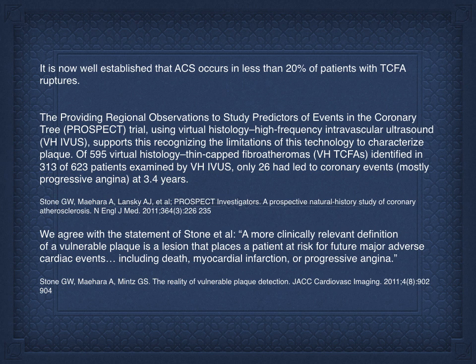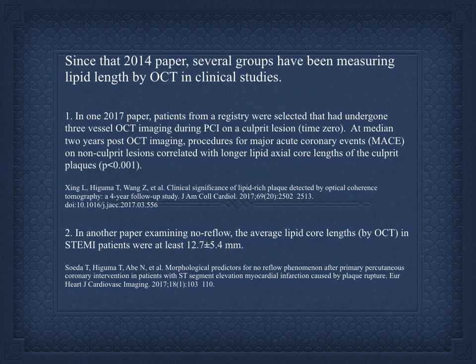distribution. So we've known prior to the PROSPECT study that less than 20% of TCFAs lead to acute coronary syndromes, but the PROSPECT study obviously was very important in confirming this, and I repeated that quote from the Stone group below. Now, our 2014 work started with a patient at Geisinger Hospital who had 2 TCFAs during a stent placement, one proximal, one distal, and they were undergoing OCT imaging.